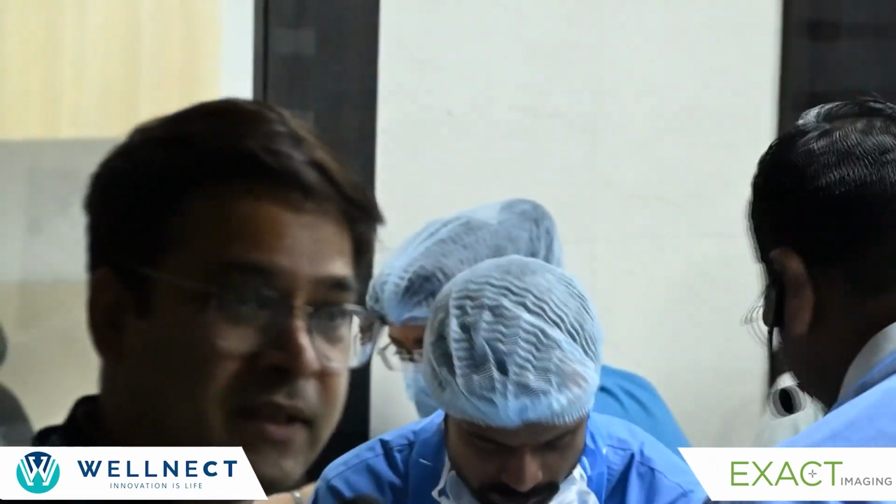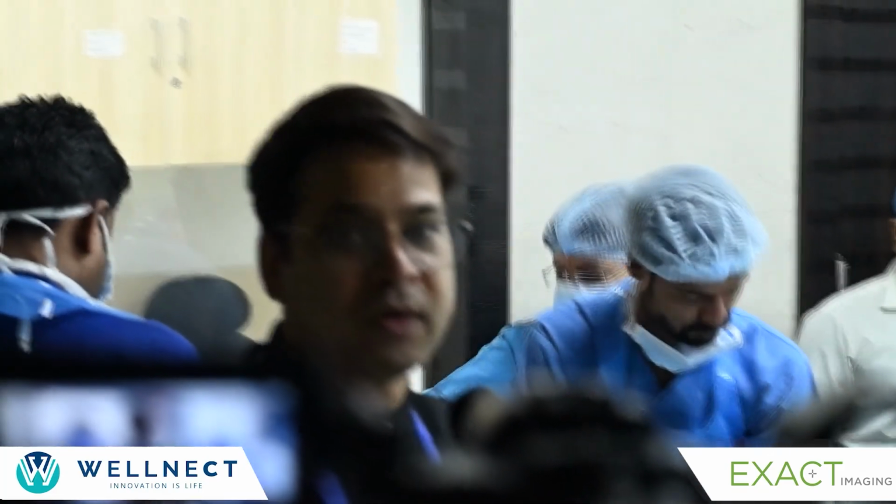So I think it is very clear what we have seen right now. One thing we have seen is that the system was compact, and on one side we have seen some echogenic shadow. If on ultrasound you can see this echogenicity, it means there is no hydronephrosis. When hydronephrosis develops on ultrasound, the echoic shadow will be replaced by an anechoic area. In this case, we have seen there was no anechoic area, since the system was compact and there was no hydronephrosis. So ultrasound will easily assess whether you have hydronephrosis or not; whether it is mild, moderate or severe generally depends upon the calyceal dilatation.